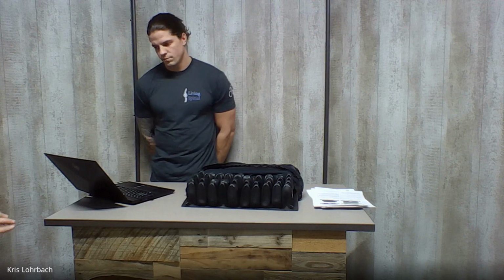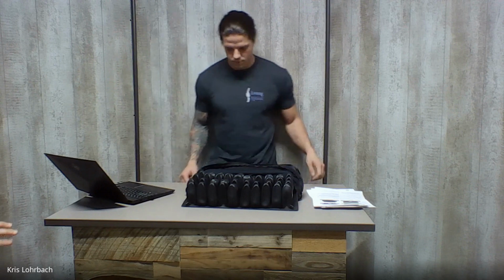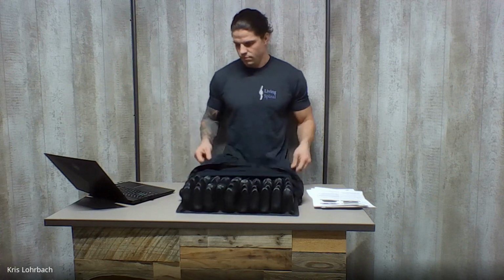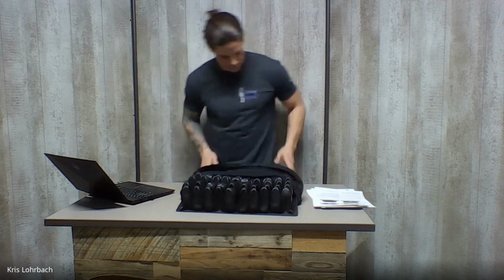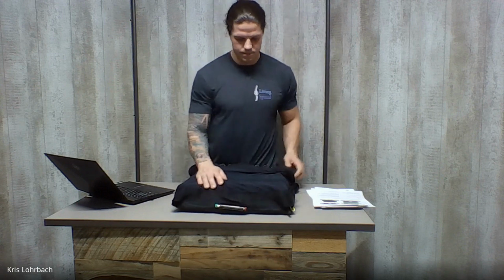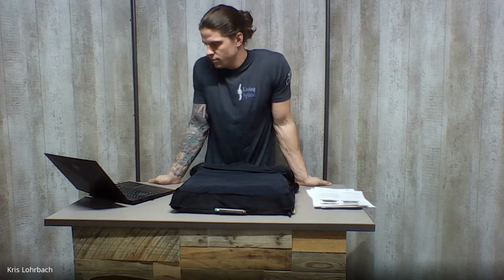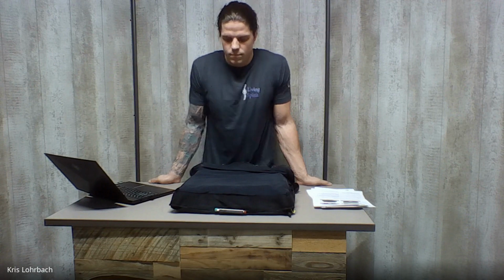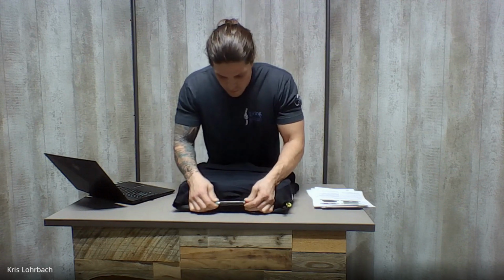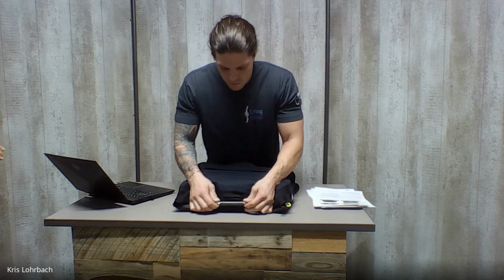One of the things that's really neat about this cushion is this one is a quattro. Okay, so Sam, if you brush that off a little bit and then spin it around, you'll see that there's a valve on it. Red and green. Right now it's pushed to red, and what that means is the valve is closed. When you say quattro, that cushion is broken up into 4 sectors.